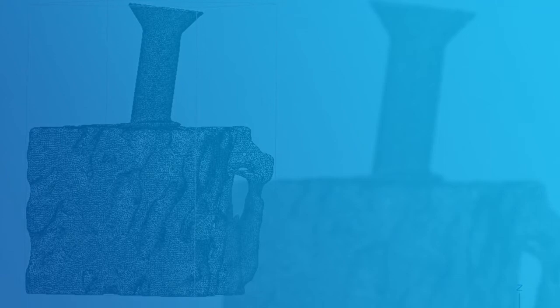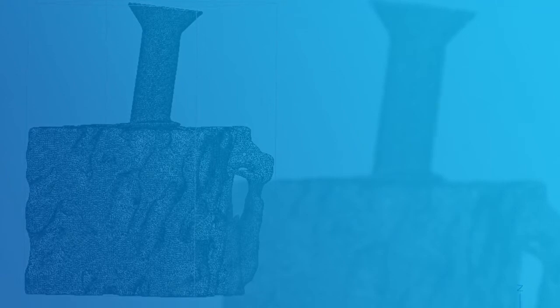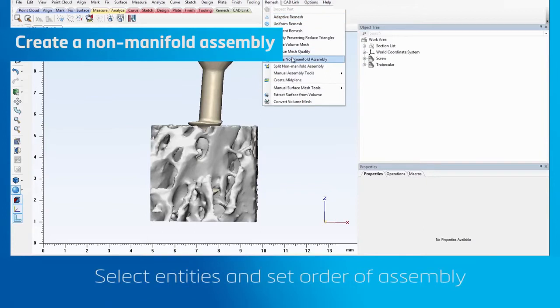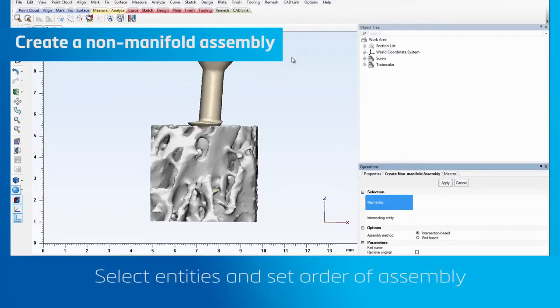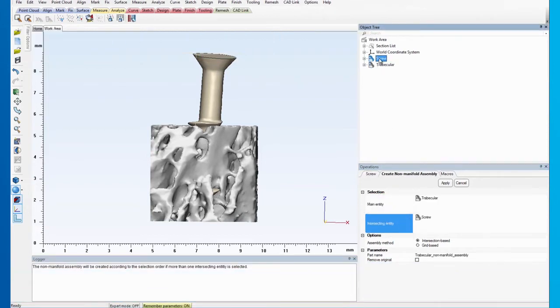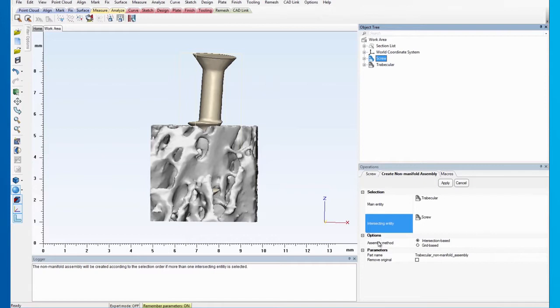First, let's create the non-manifold assembly. Go to the re-mesh menu and click on Create non-manifold assembly. Select the trabecular as the main entity and the screw as the intersecting entity. Make sure not to do this the other way around, as it will change the boolean order between the parts.